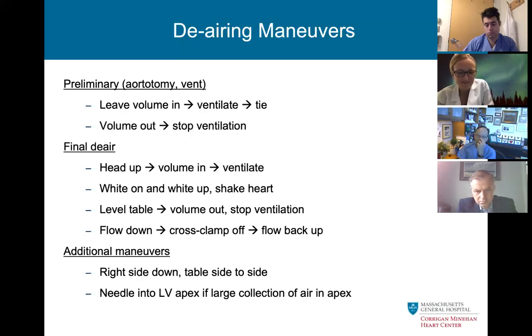I will just add one brief anecdote. When I was chief resident, Bill Daggett did a very advanced mitral stenosis case in a patient that had a giant left atrium. And when we got up to the ICU, there was a circular area of increased density on the chest x-ray. And on the lateral film, there was an air fluid level in the left atrium, and we went back to the OR very carefully, actually in the patient's bed, and took 32 cc's out. So the echo is very important, and I would urge that people be engaged in looking at the air on the echo.